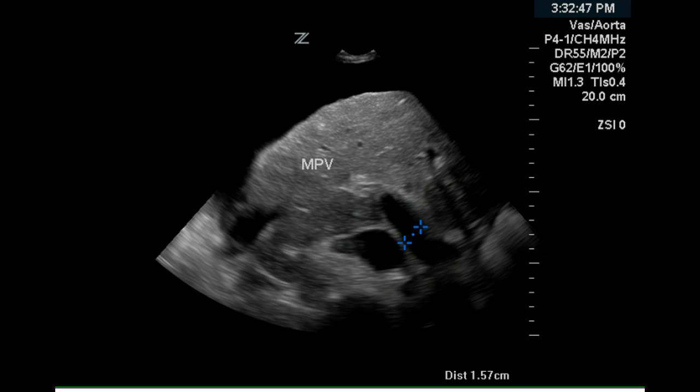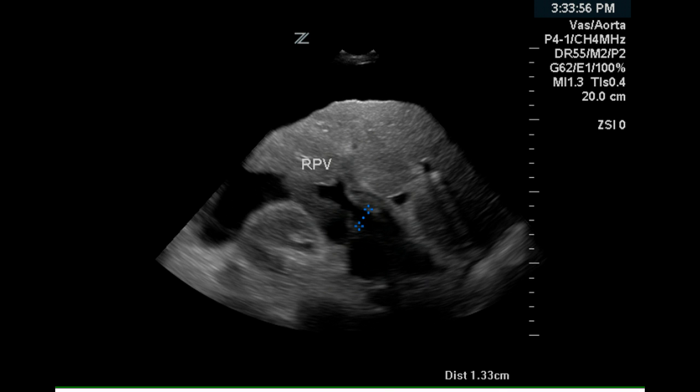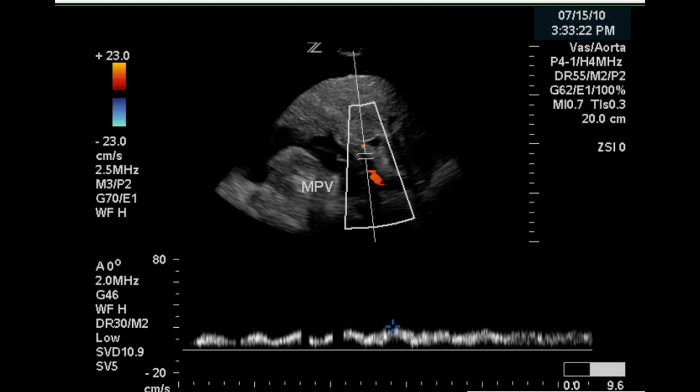The main portal vein has been measured and is 1.57 centimeters, which is larger than normal. The doppler waveform of the main portal vein demonstrates near continuous flow into the liver. Flow is hepatopetal.